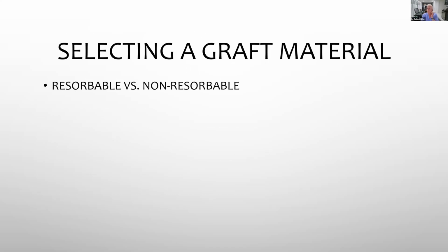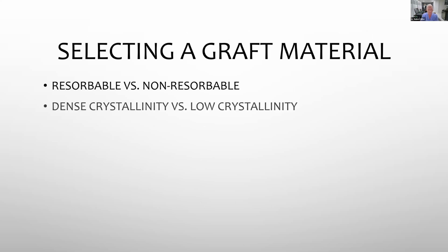So is it resorbable or is it not resorbable? Well, again, it depends on what you want to do. If you want to place an implant, don't place non-resorbable. It's not going to turn over into bone. At the same time, if you want it under the intaglio surface or a pontic of a fixed restoration, don't use a resorbable material. So there's no bad materials, just bad applications. Is it dense crystalline, low crystalline, or even for that matter, non-crystalline, because that's going to affect the resorption time. How soon do you want to go back in to place your implants?